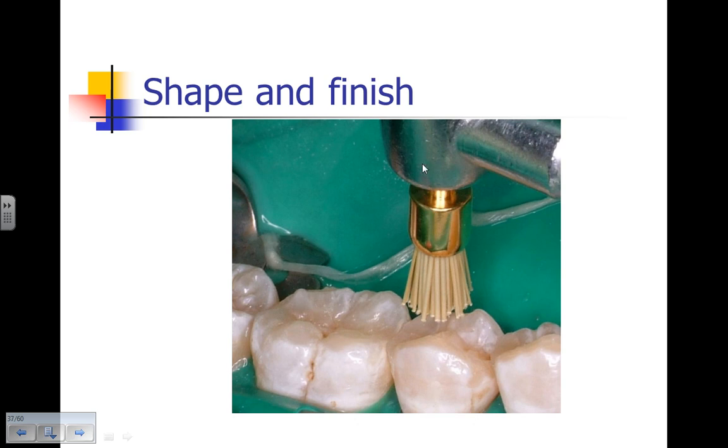In some cases, I might polish using a diamond impregnated nylon brush instead of the enhanced polisher. And here we're looking at a diamond impregnated nylon brush that's reusable.